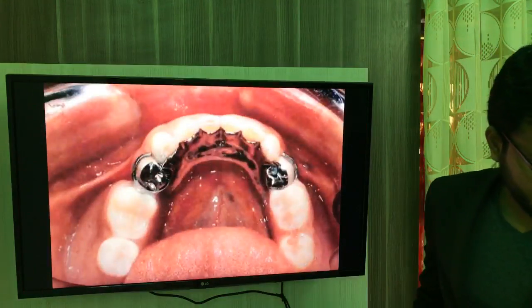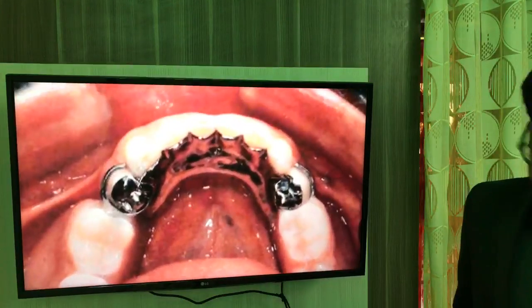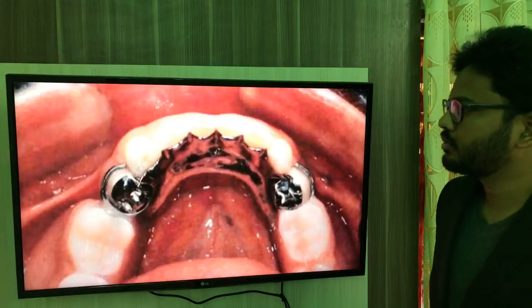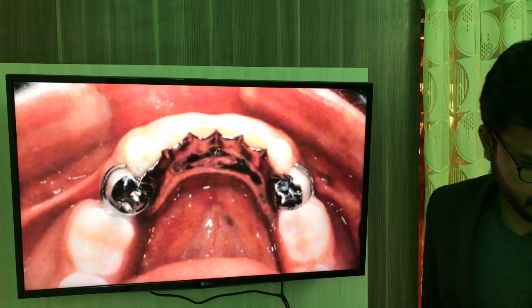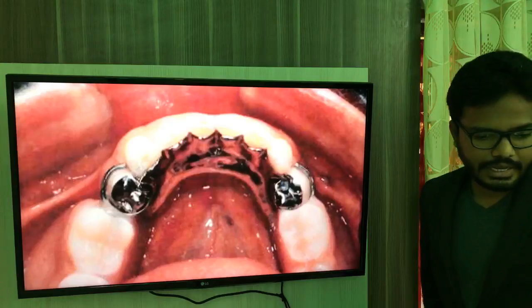And what does this represent? Good. So this is obviously a lingual plate.